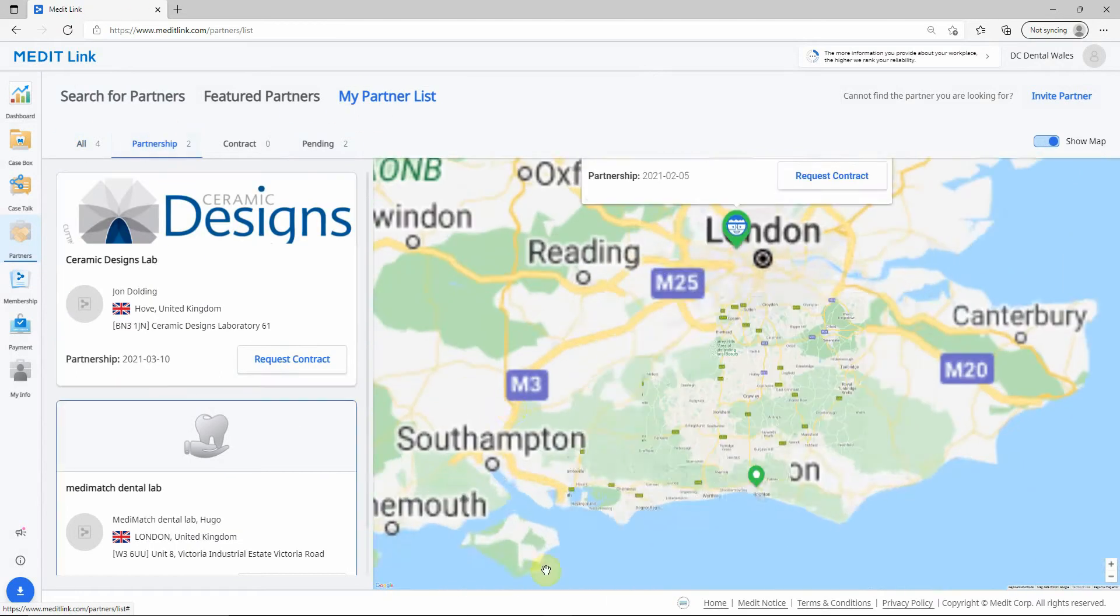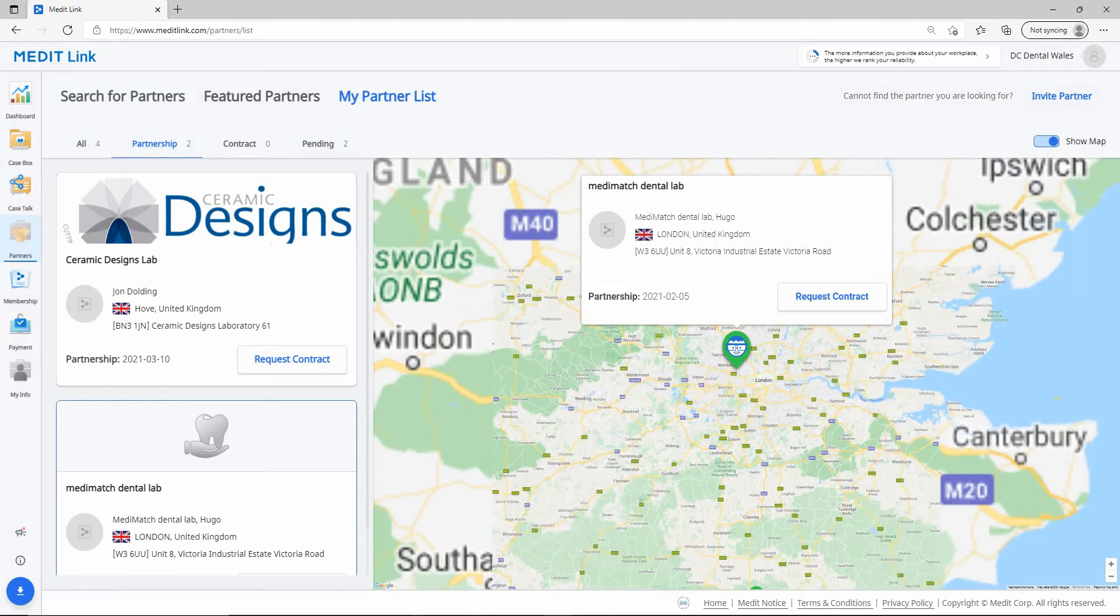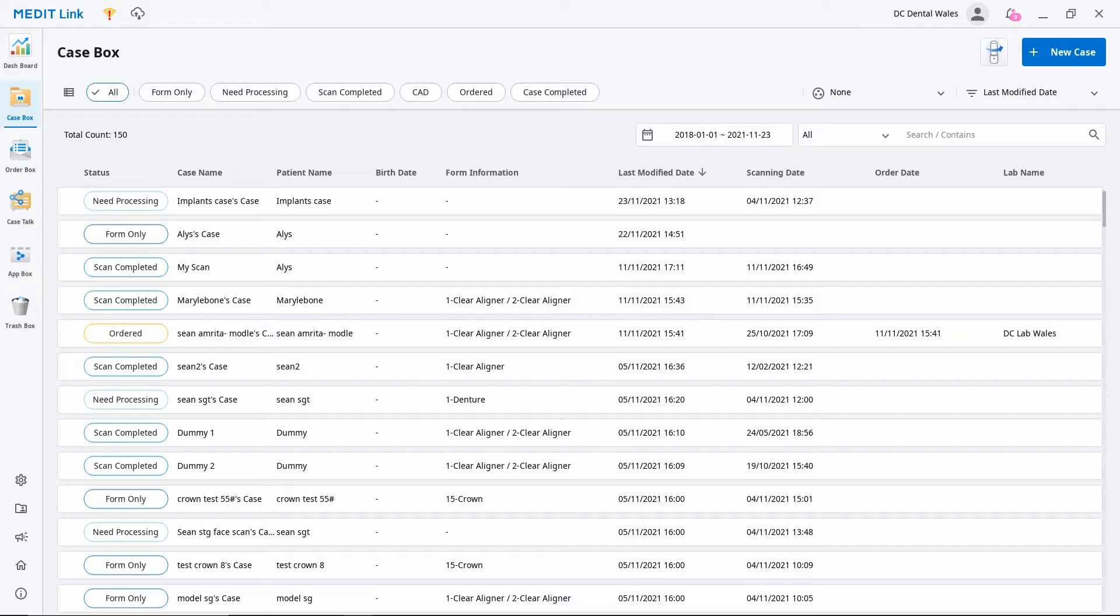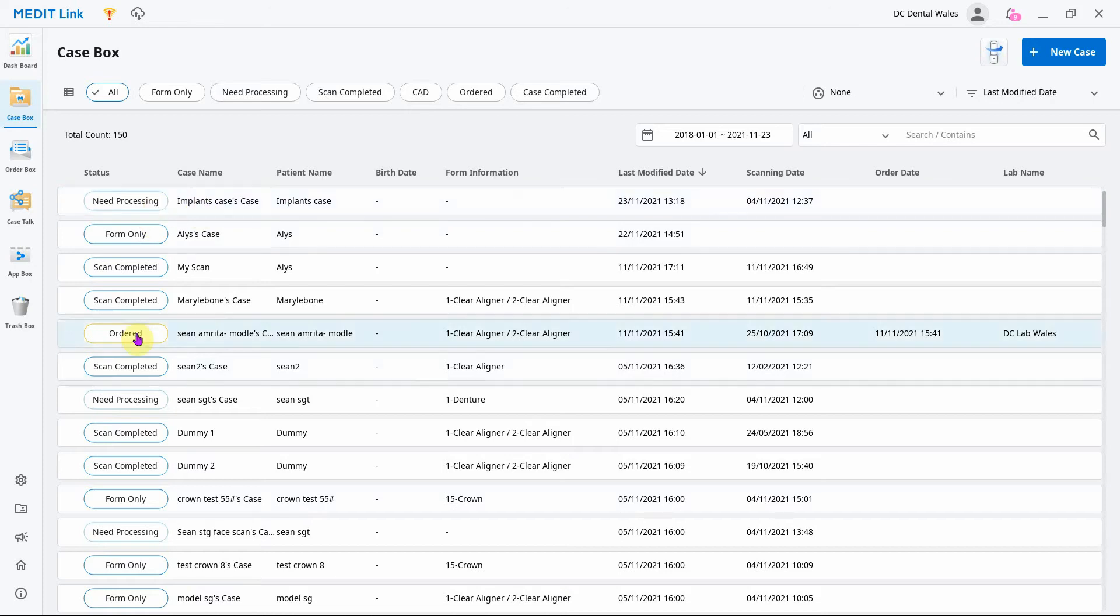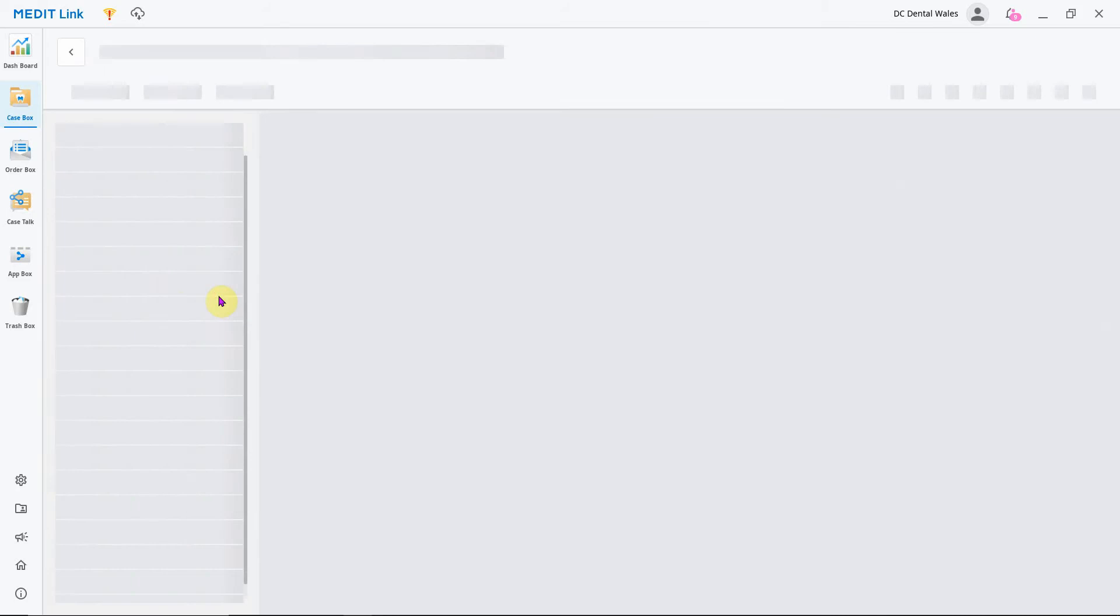you can then go back to MeditLink, the main software, and on any case that's got scan completed next to it, once it's finished processing, you can click on it.